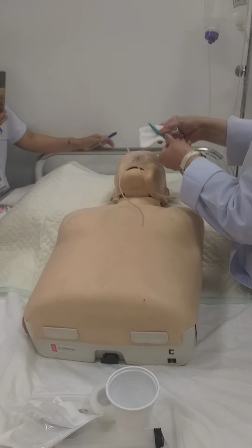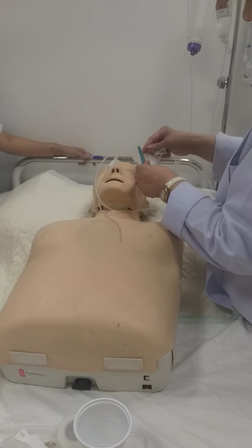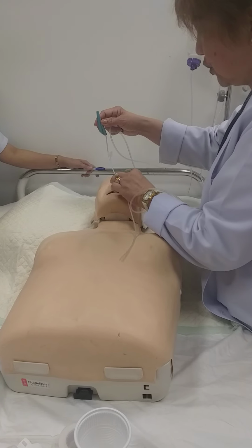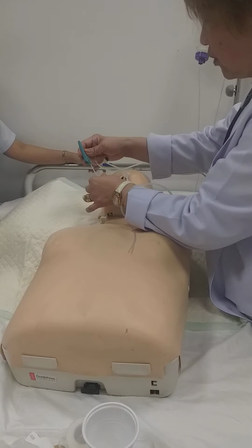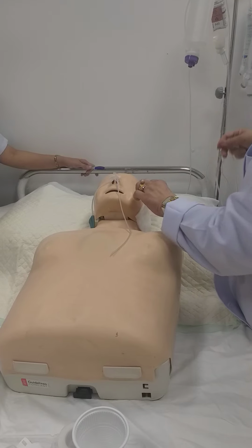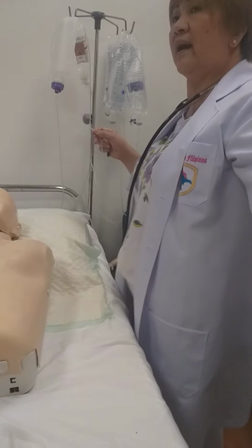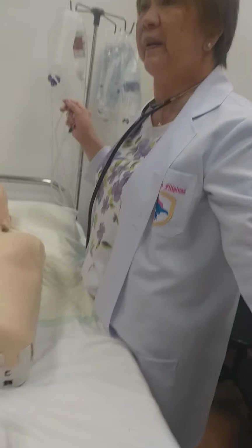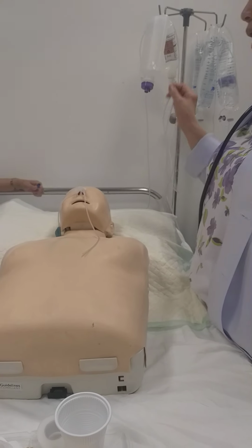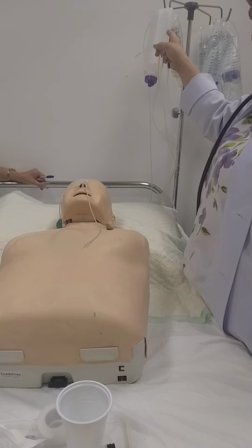Okay, and you have to pinch, open, close, and the same way, you have to put the butterfly on the cheek. Now, what we will do with this, once it is done, we will throw it into where? Anything that has contact with the patient, where are you throwing? Medical waste. Medical waste. Okay, so if the doctor orders only 500, so you have remaining 500, right?